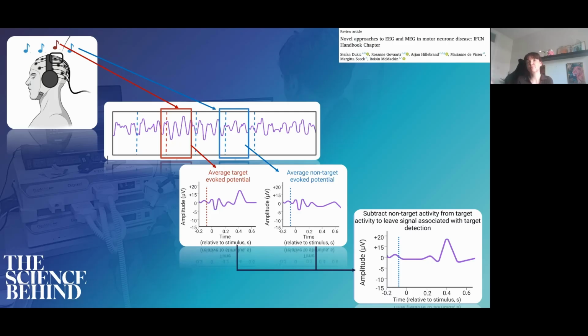You can measure both the size of the peak, or the amplitude, or the latency of the peak, which means how long it takes for the peak to appear. And these can give you really great insights into whether certain brain networks associated with your task are suitably activated in that person, or if there is a slowing of the networks required to perform that task. And then, of course, you can measure if your drug normalizes or reduces that change that is associated, for example, with the disease you're studying.